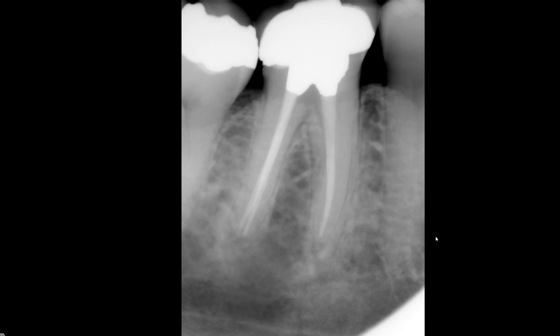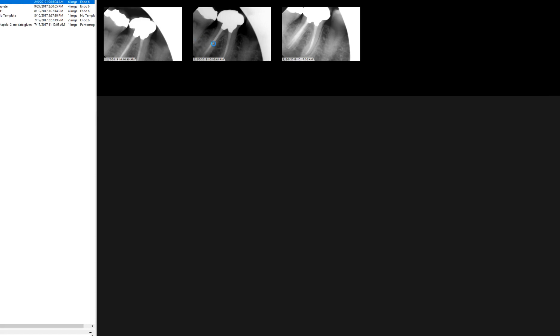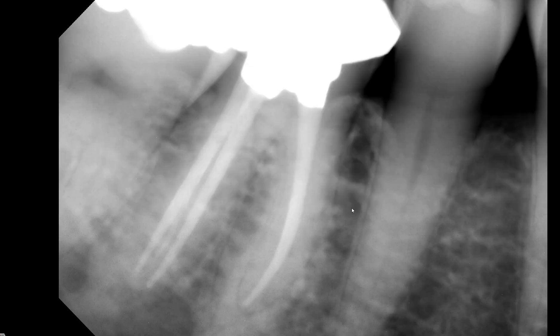The patient presents to our clinic with a chief complaint of continuous or intermittent pain, and something doesn't feel exactly right. So what do we do? We take a periapical radiograph of that patient, and this is what we see.